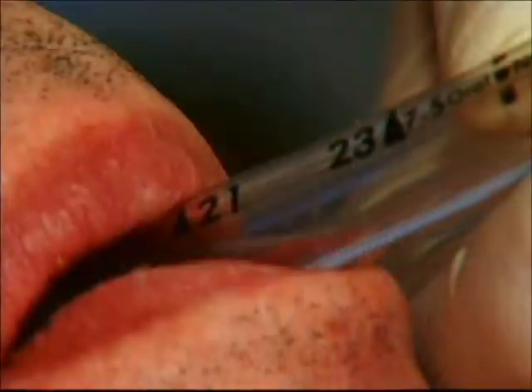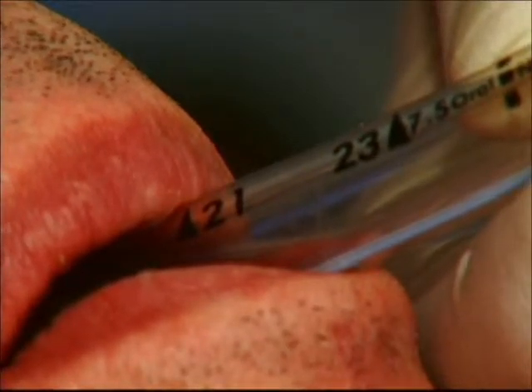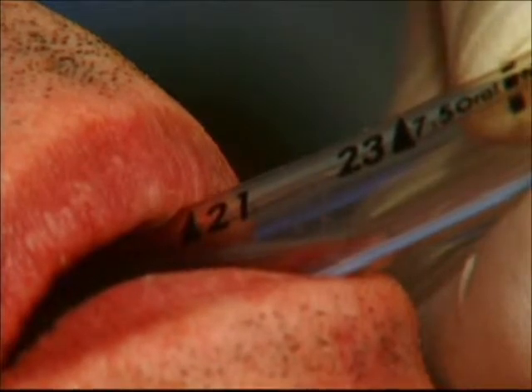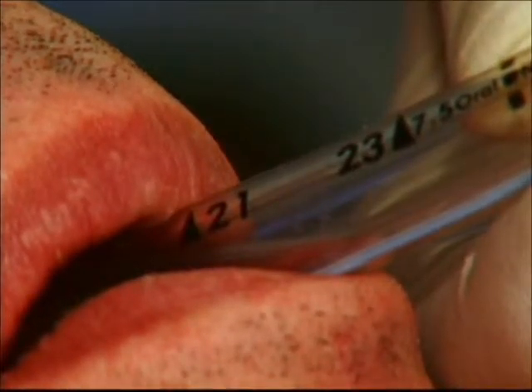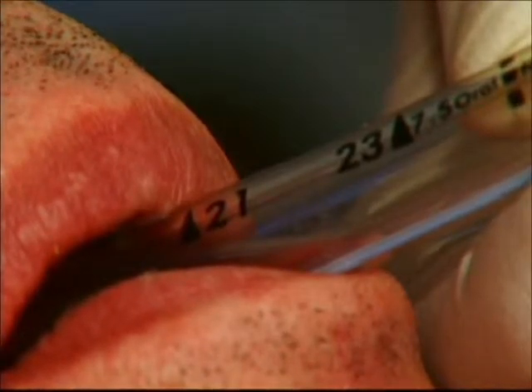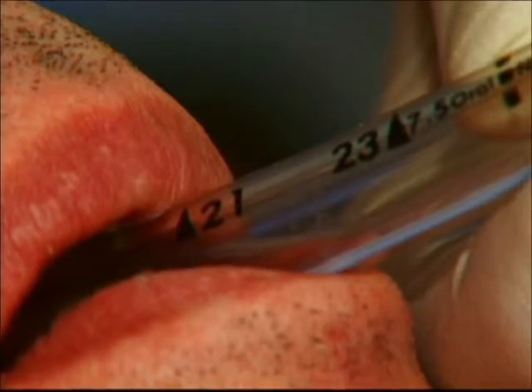Prior to securing the endotracheal tube, note the depth to which the tube is placed. There are centimeter markings printed on the tube. Check the markings on the side of the tube and note the centimeter marking nearest to the closest anatomical landmark, such as the nares or nostrils for nasal tubes or the lips for oral tubes.